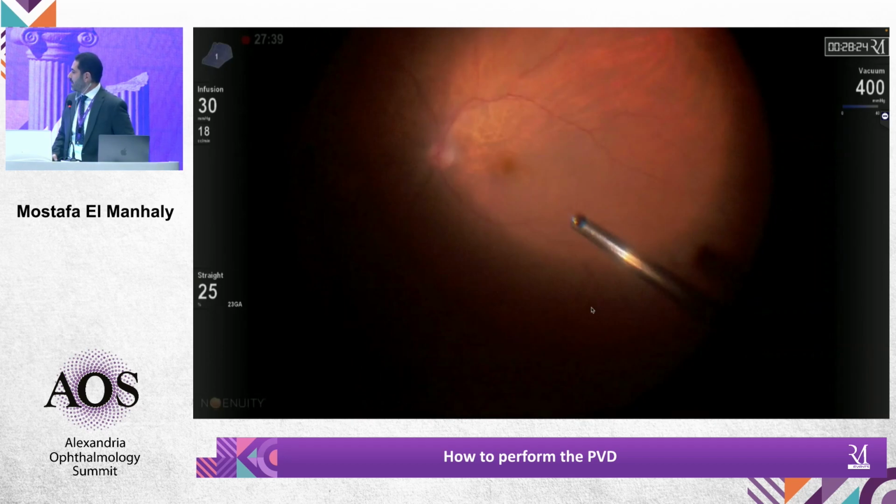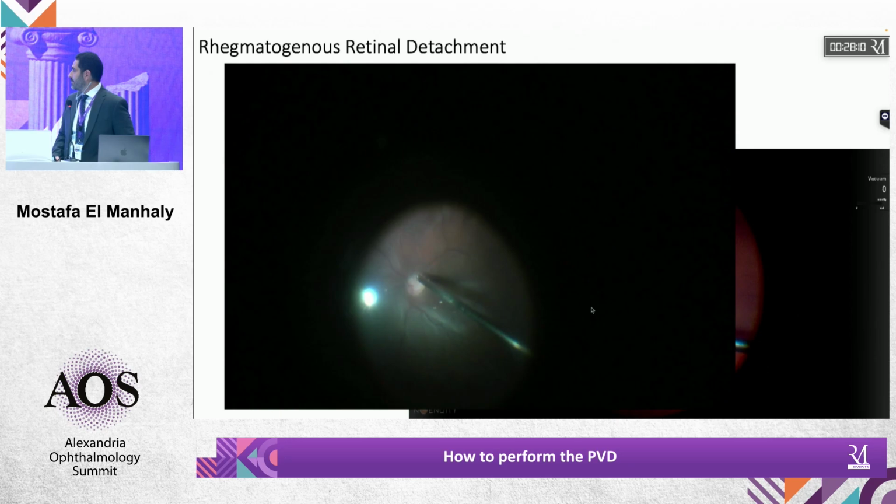Dr. Hany and Dr. Hassan, please. One more comment is that if you can create a fluid cavity by a core vitrectomy in which you can pull this nuclear material inside and then activate the ultrasound, I think you won't exert peripheral traction. But these are different opposing points of view, and both are valid.